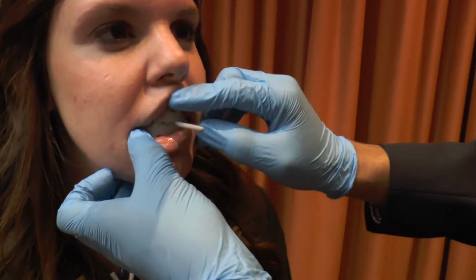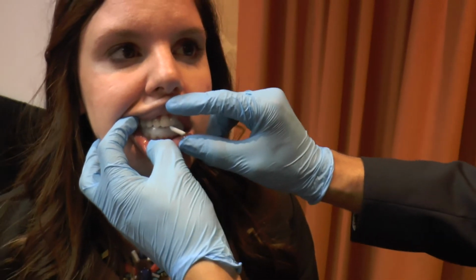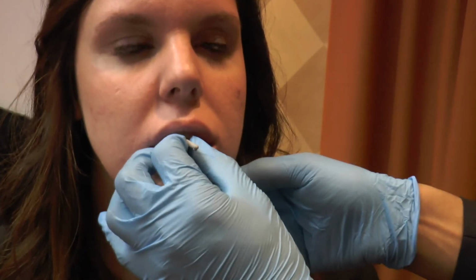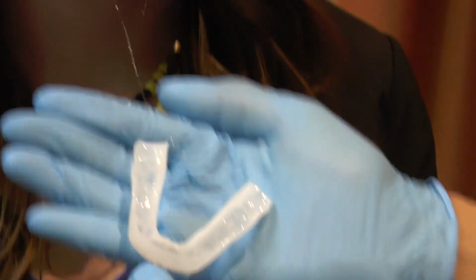So you want to check, and what you're looking for is to see the return of that white color as opposed to clear, suggesting that it's pretty much set. Go ahead and open it for me. And we are going to passively just remove it and then let it finally set outside the mouth.